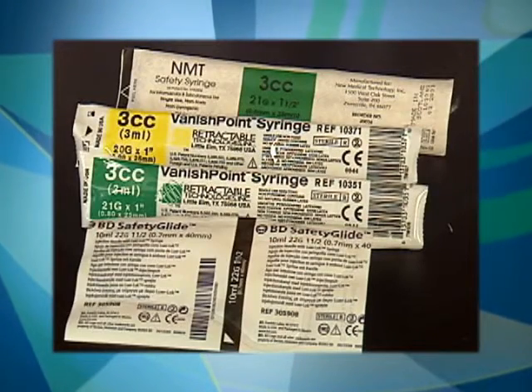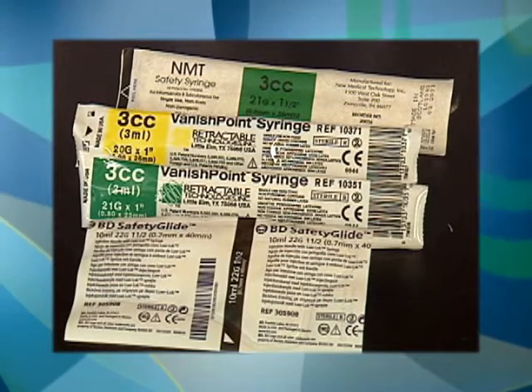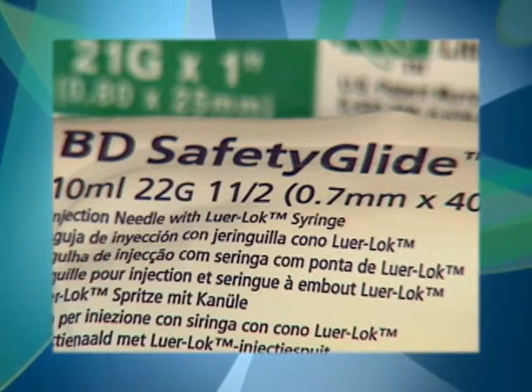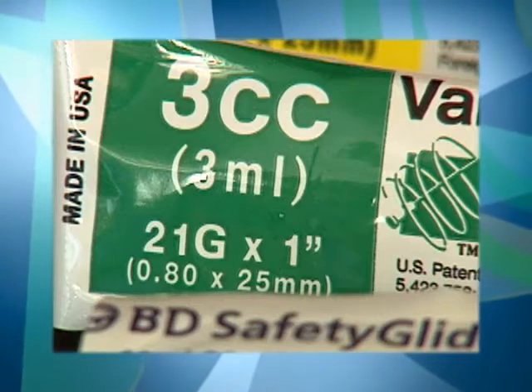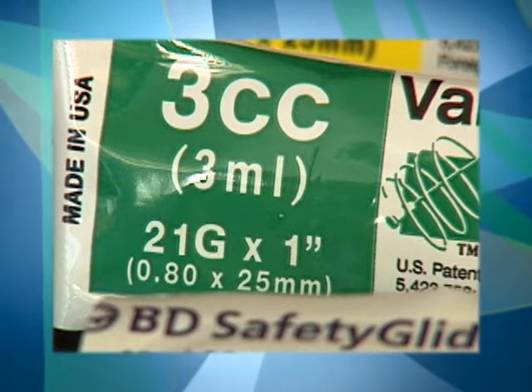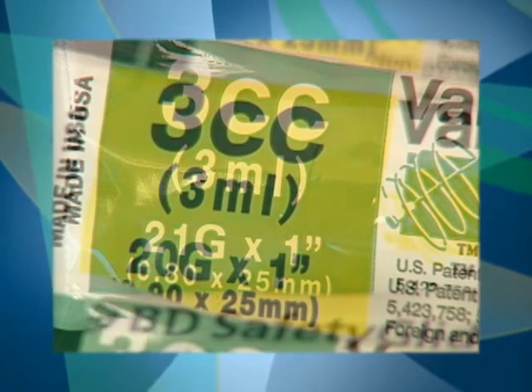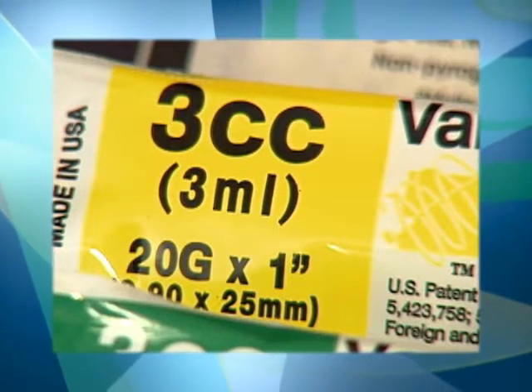The length of the needle for an IM injection varies from 1 to 3 inches, depending on the size of the patient. A 1 inch to 1 1/2 inch needle is typically used for an average-sized adult. The gauge of the needle ranges from 18 to 23 and depends on the thickness of the medication being administered. Thick and oily medications require a needle with a bigger lumen.